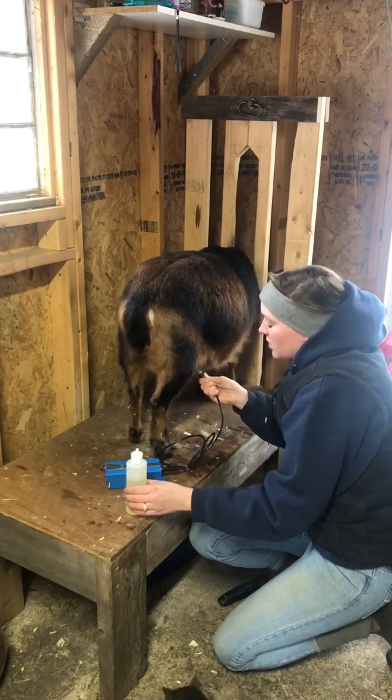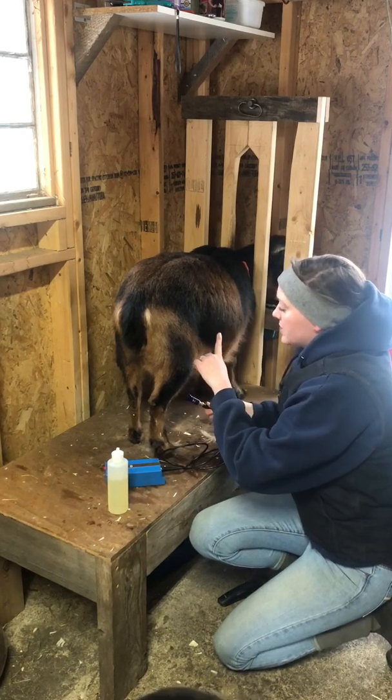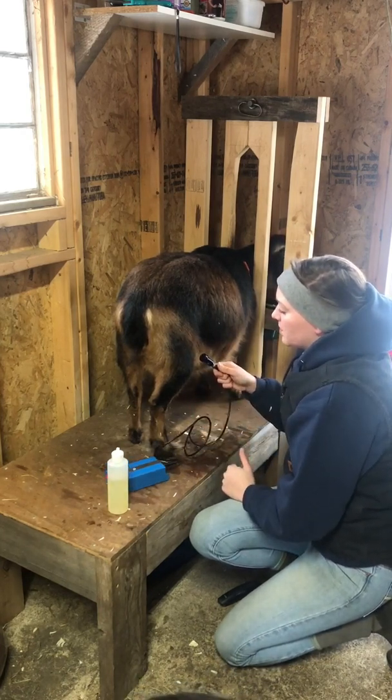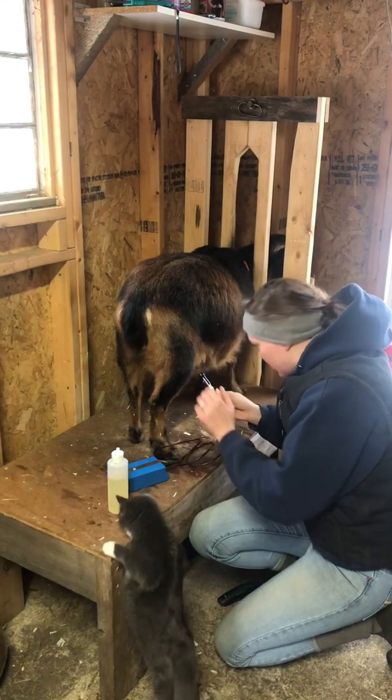The same situation goes with goats as it does with pigs — their bladder is in the back, their uterus is towards the front. So you don't want the probe pointing backwards; you want it angled towards her front shoulder.